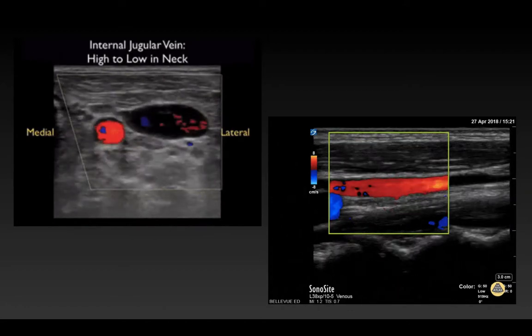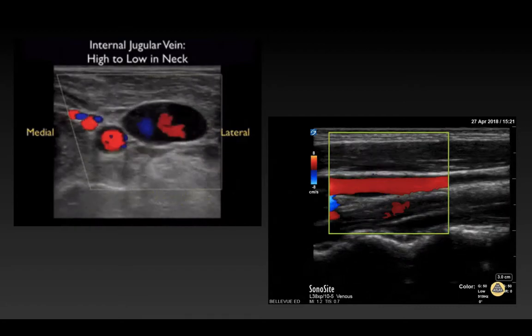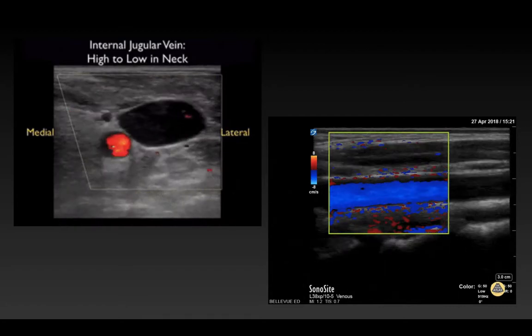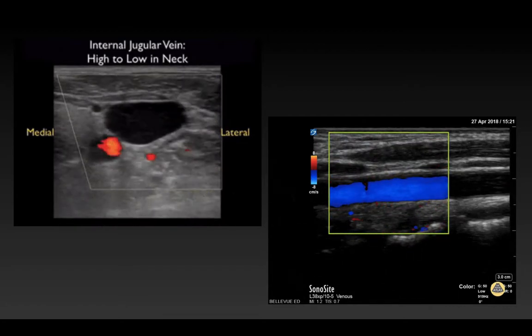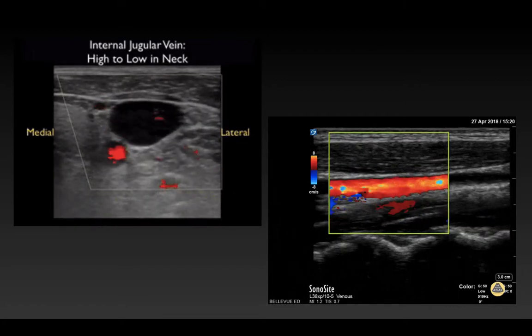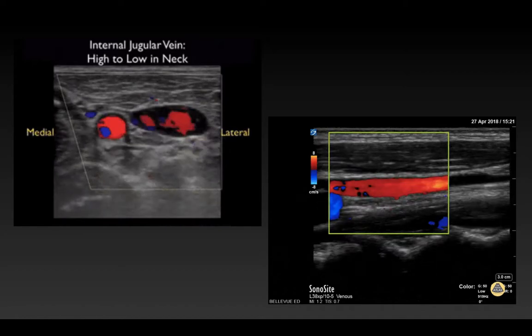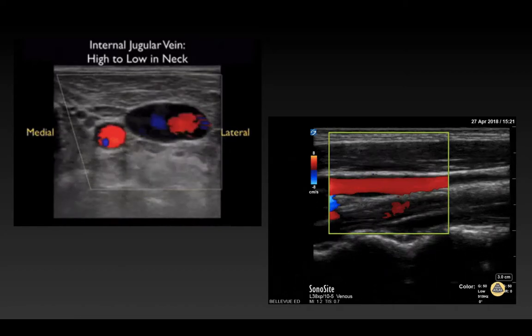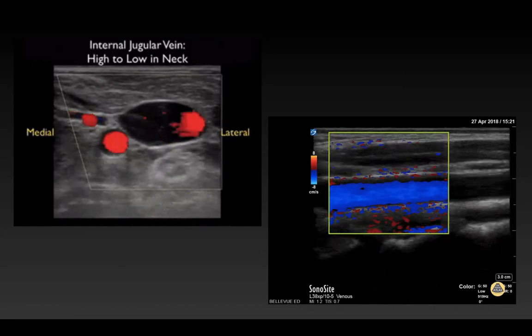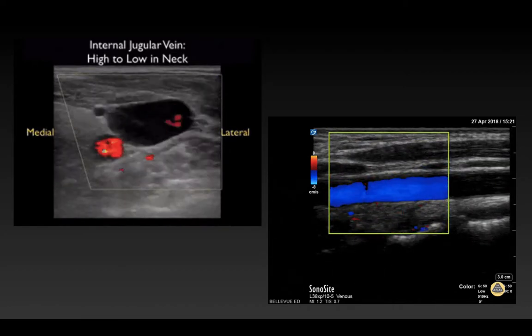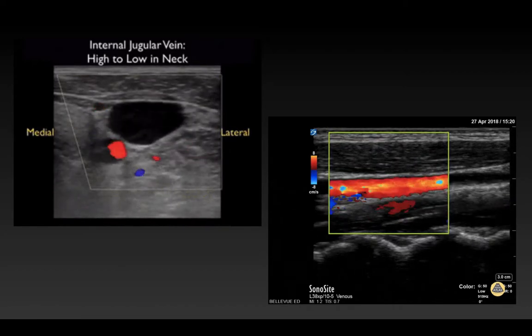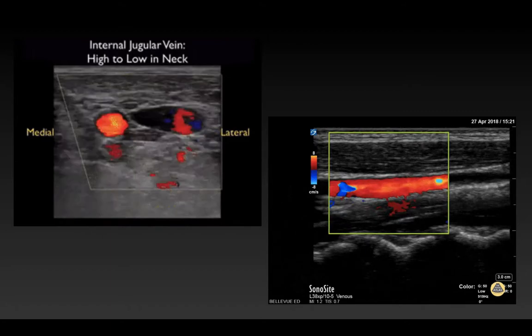On the right side of the screen, we're doing a similar scan, evaluating the internal jugular vein and the carotid artery in an in-line approach.